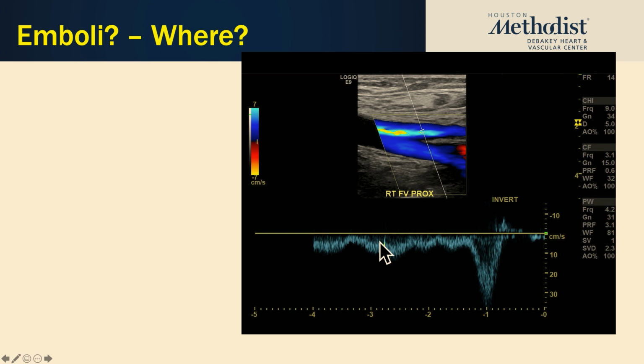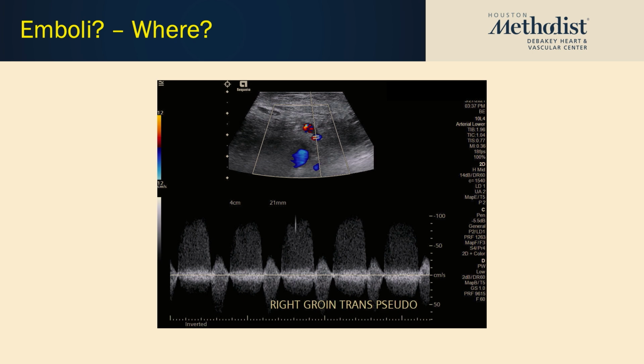It's just a tiny microembolic signal telling me that proximal to this measurement, there's a source which is giving me that microembolic signal. And again, the other place where we see clots, and we never pay attention when we see this brightness because it's just a single snowflake. This is a pseudoaneurysm in the groin. And what you see here is one single microembolic signal. So this is a tiny particle, because the signal is again generated from a red blood cell. So something else traveling between those cells is giving us the signature. The size could be anywhere from 10 micron to 100, 200.